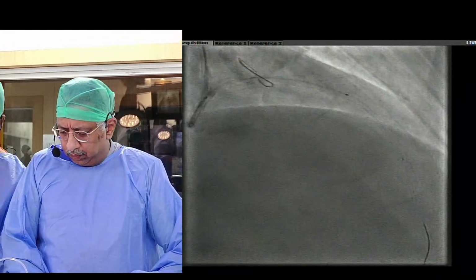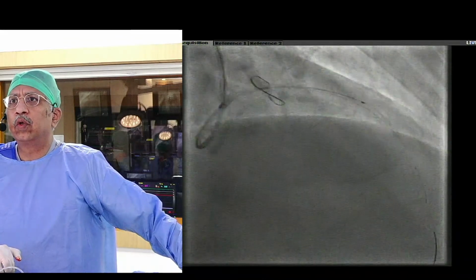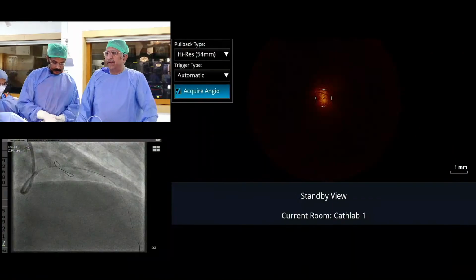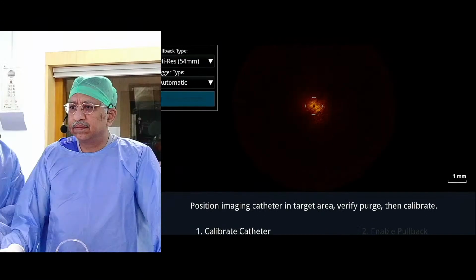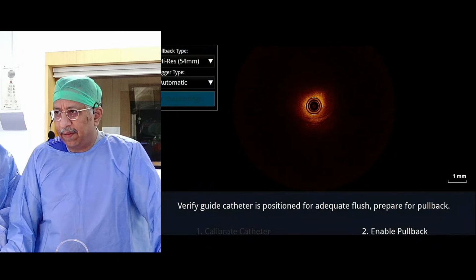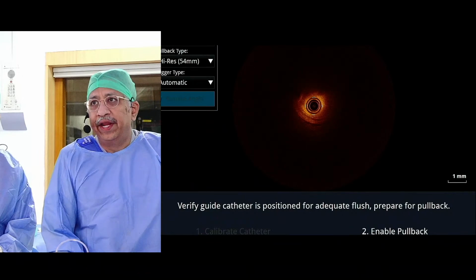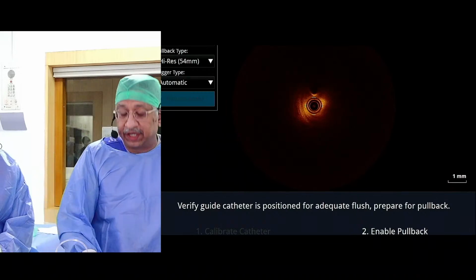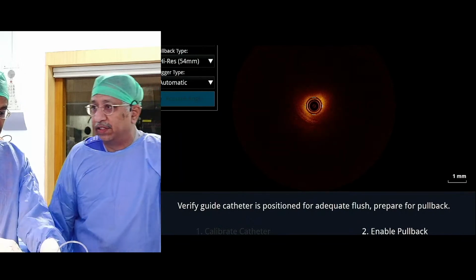Okay. Good. So are we ready for the shoot? The port. Okay. Right. Good. So can you go live on the OCT? So Ronnie, let me ask you one key question here. Is this high resolution on purpose in the left main for this specific purpose, or are you a high-res guy? Although I'm sure you are. Yeah, but it's a very good question. It's very important that you do a high-res shoot on this, because now we're not looking at the MLD max, we are looking at the strut. And if you want to see the strut, you need a high-resolution picture.